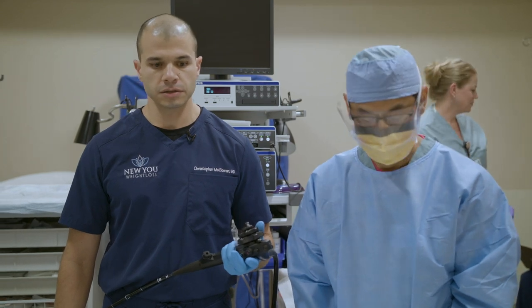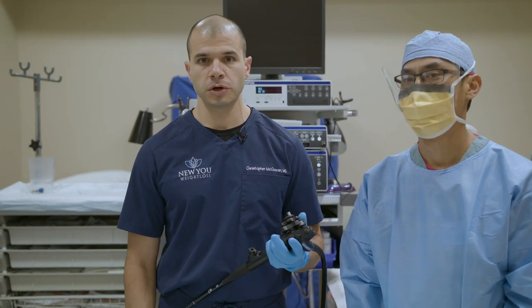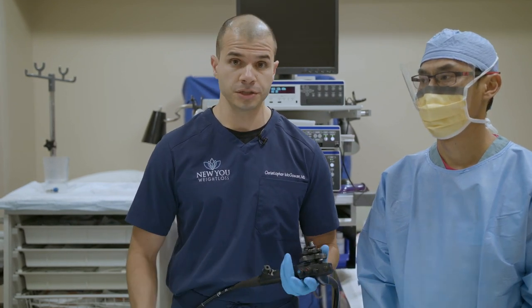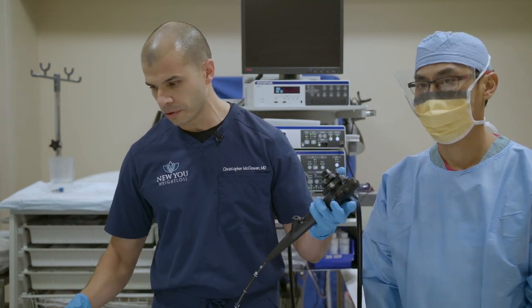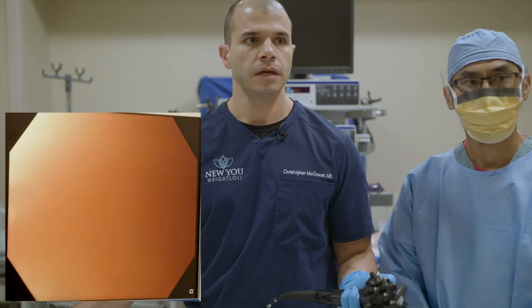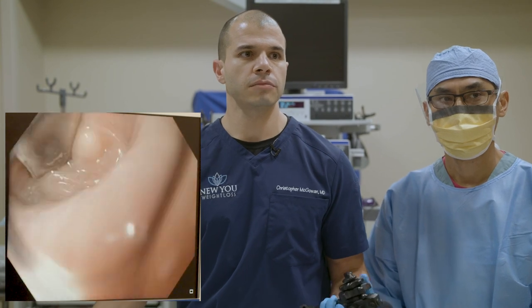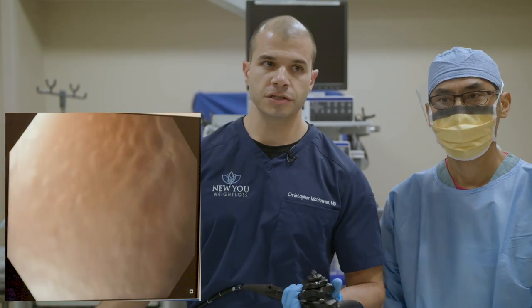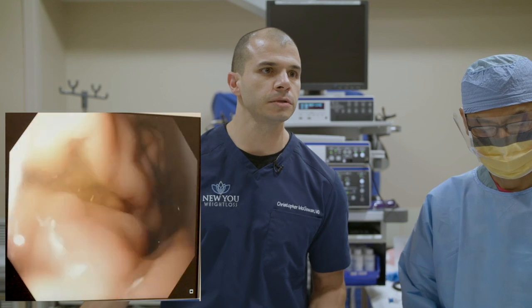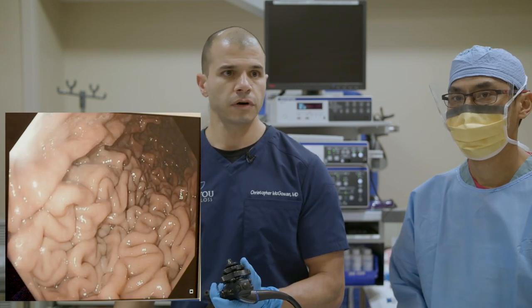The ESG is an incisionless, non-surgical procedure. We're going to make the stomach smaller by suturing it from the inside instead of any external incisions. The smaller stomach will lead to weight loss by allowing our patient to eat less over time, feel full, and lose weight. Our patient is under general anesthesia — she's asleep and comfortable. Our average procedure time is about 38 minutes, though today it may take just a bit longer.